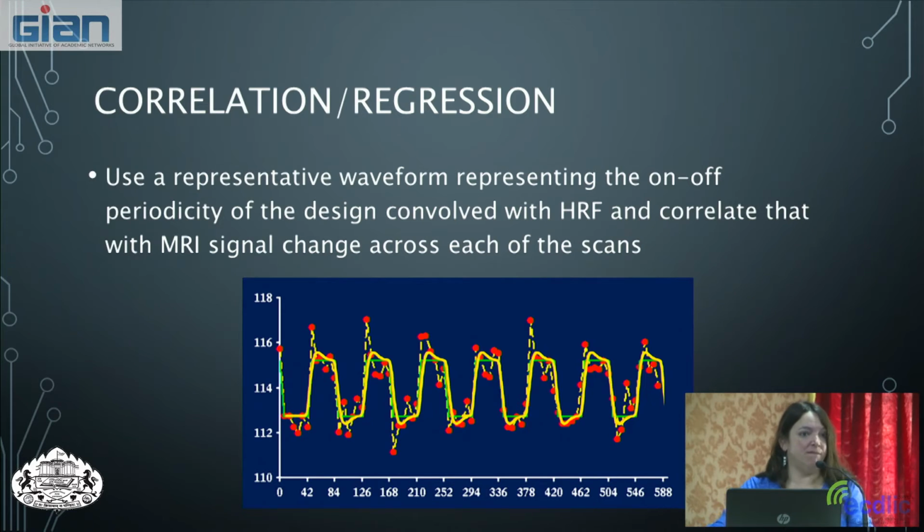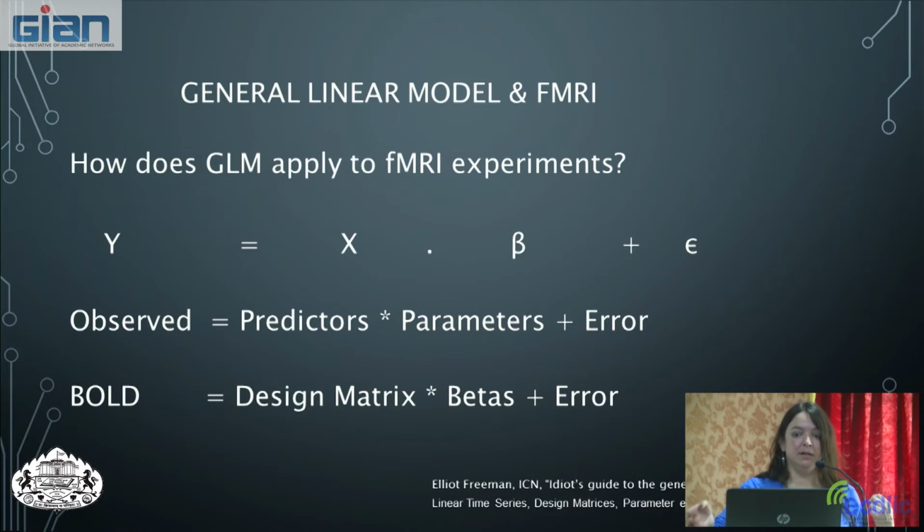And we're going to try to fit this curve to see whether our model looks like what's changing in our recorded data. So we're going to try to fit our model to our data and estimate parameters to see how well it fits. Okay.